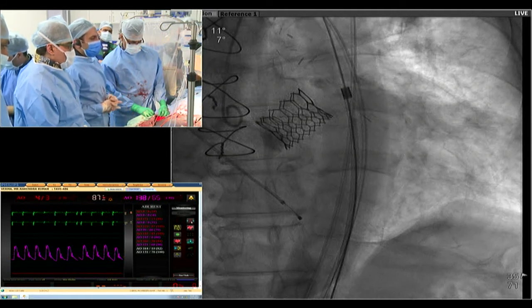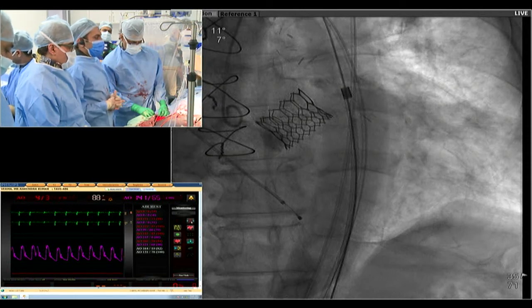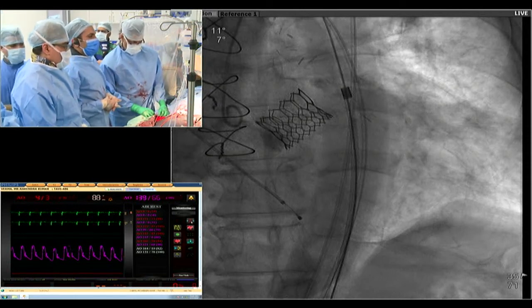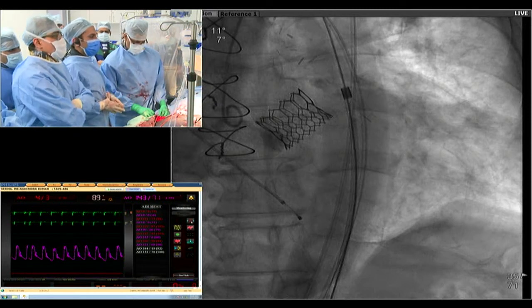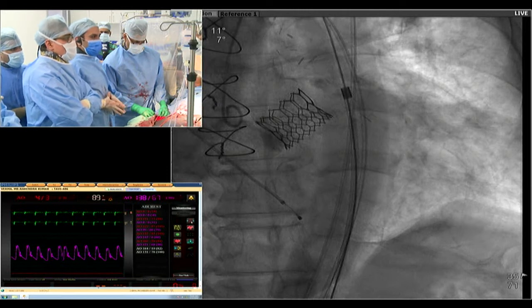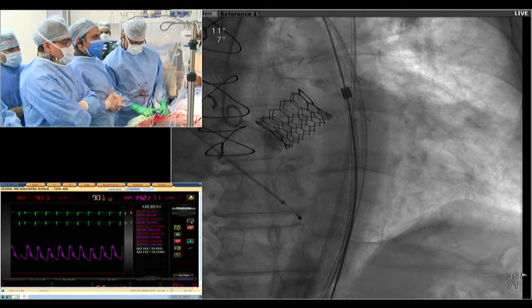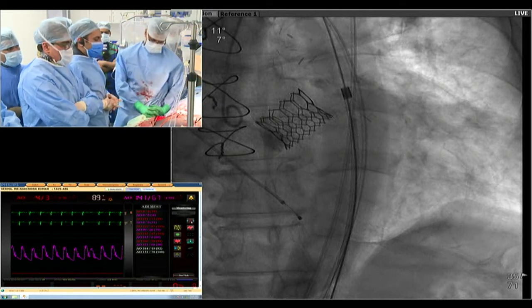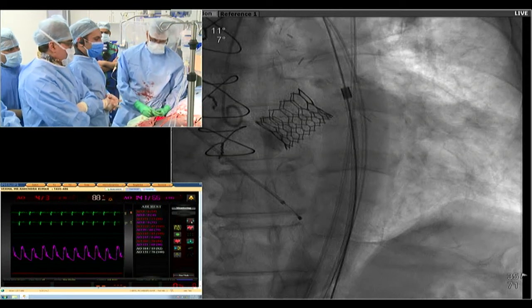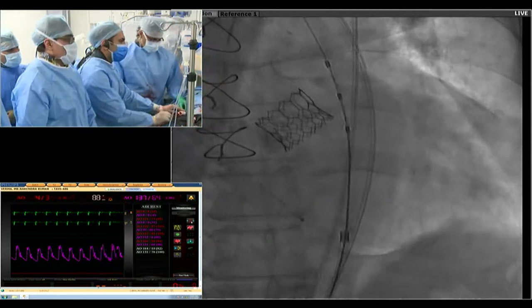Now, coming to the Sentinel trial, there was no statistical difference, as you know. But still, it got FDA approval just because the judges there wanted a device in the carotid when patients are undergoing a TAVR. We are not using it as a routine practice. What is your practice? We don't use protection devices. And in your experience, did you find some plaque in the protection device, or no?